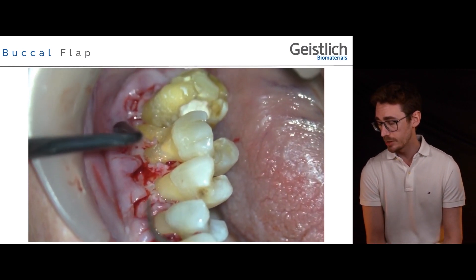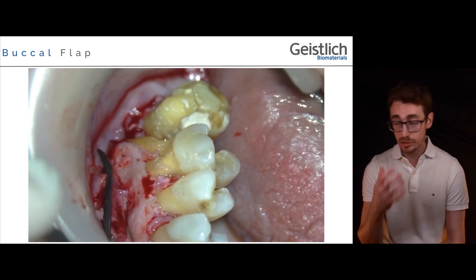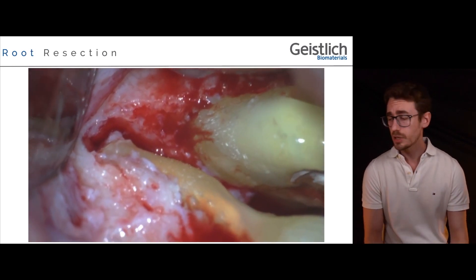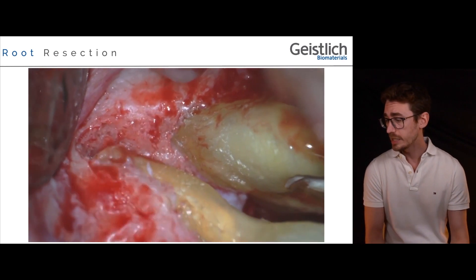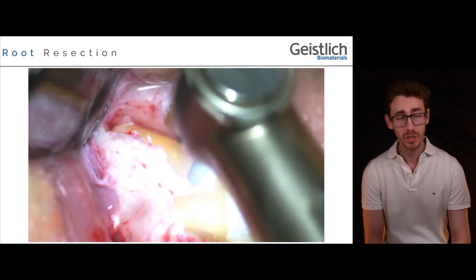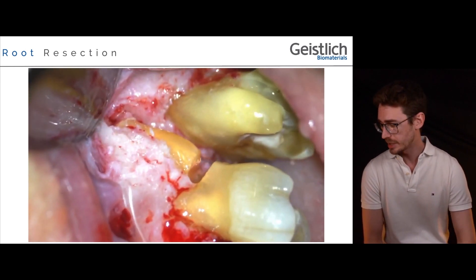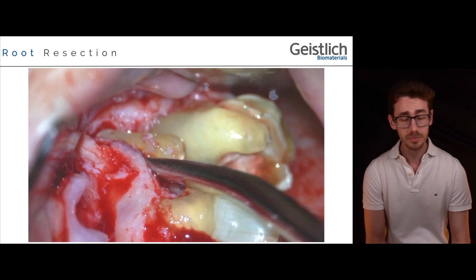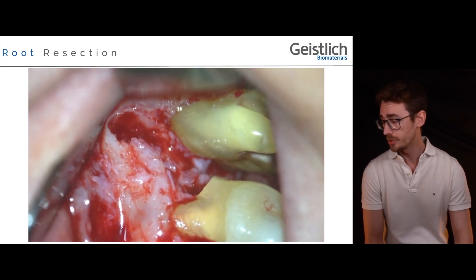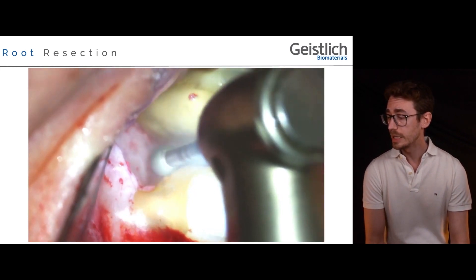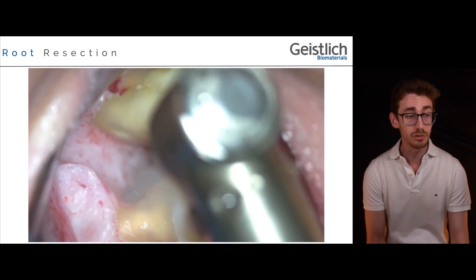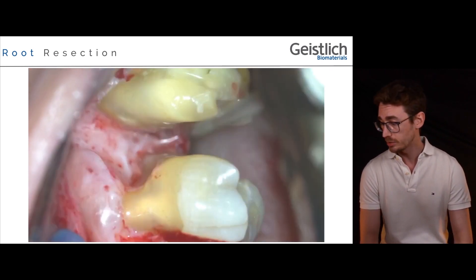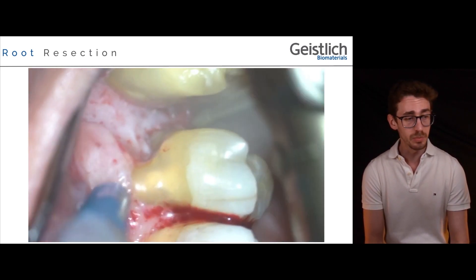The full-thickness elevation allows us to expose the defect at tooth number 26 and confirm that at the level of the distal root, loss of attachment reaches the tooth apex. With this intraoperative confirmation of defect severity, and observing a clear proximity of the distal root of tooth number 26 with tooth number 27, the decision to amputate is taken, and root resection is performed under the magnification of the surgical microscope. Using a diamond bur, a clean cut is performed and the residual distal root is extracted. The root trunk coronal to the resection is then recontoured to eliminate any overcontour that could represent a factor for plaque accumulation.